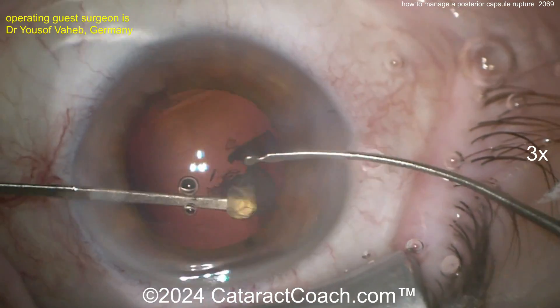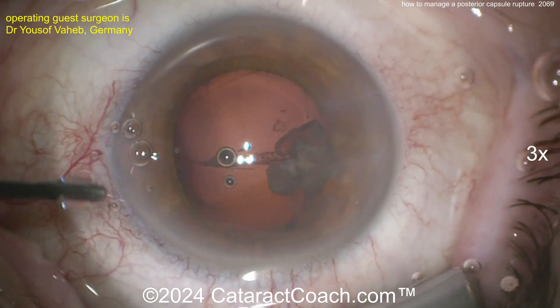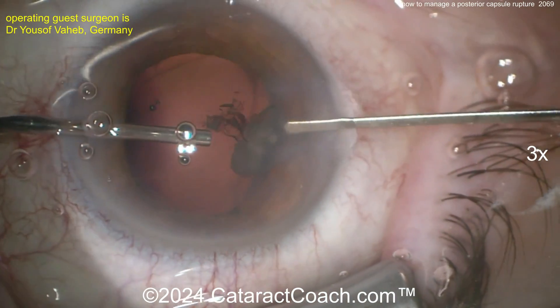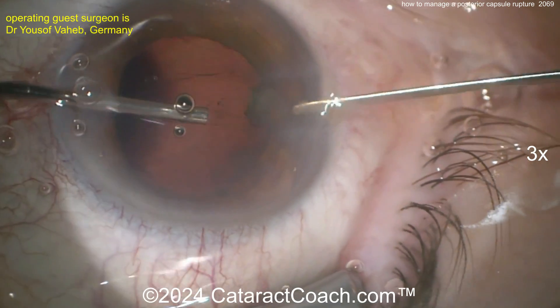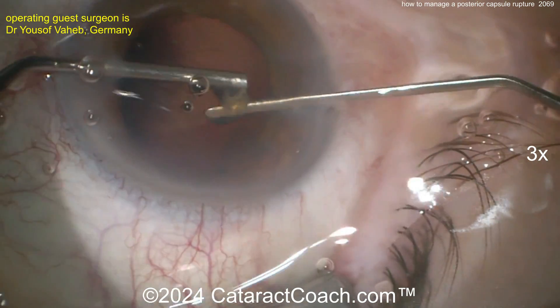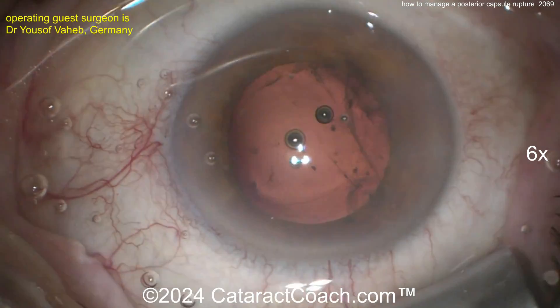Just trying to manipulate that piece and get it broken up a little. Then here's the injection of more dispersive agent — looks like HPMC, hydroxypropyl methylcellulose. Inject that, then depress that incision and guide them out. Just a viscoelastic wave pushing those pieces out of the eye. Break that piece up a little, make sure it fits through the incision — and there we go, now it's cleaned up.